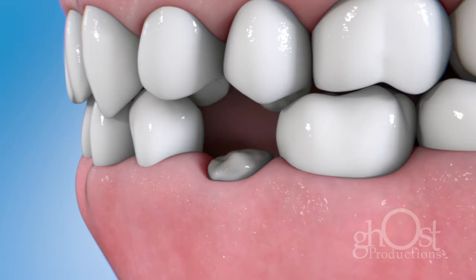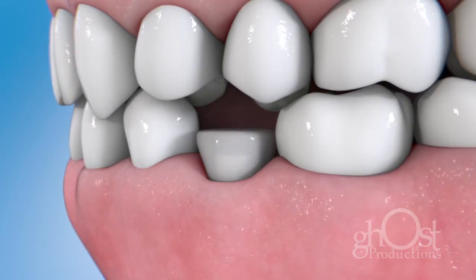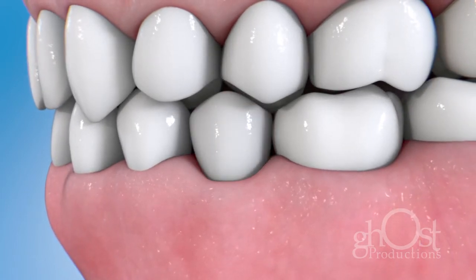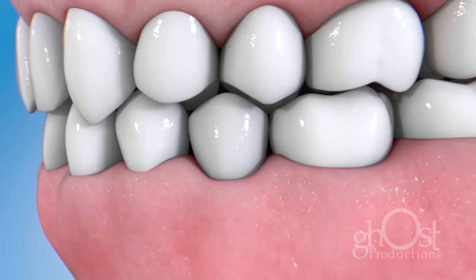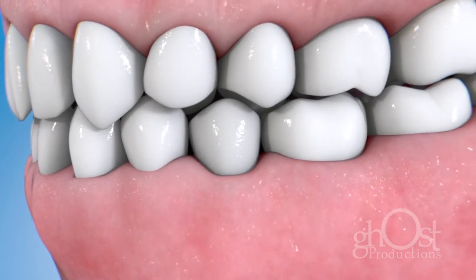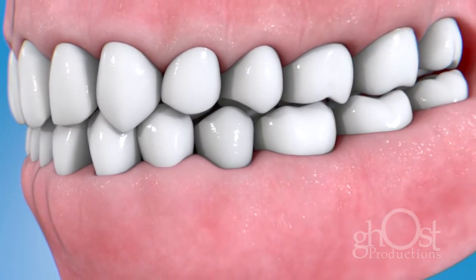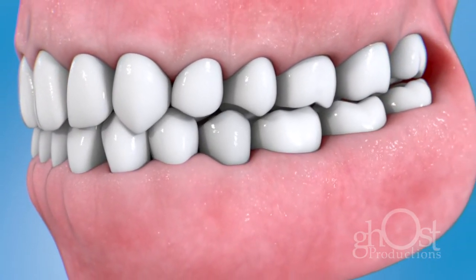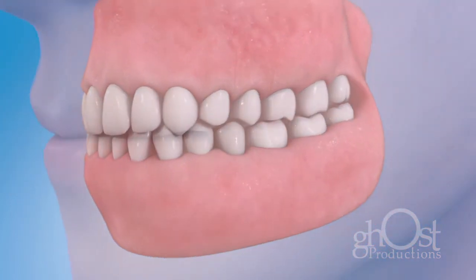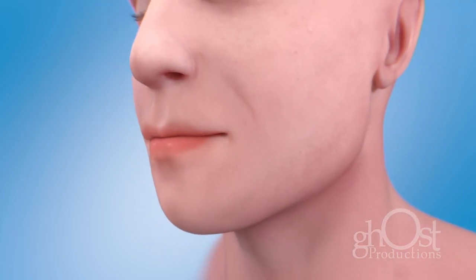It's important to follow the periodontist's instructions on postoperative healing and re-care. When the periodontist determines healing is complete, your dentist will build up the core of the tooth and prepare it for the crown. We place the crown to cover and protect the damaged tooth. This procedure saves and restores a tooth that might otherwise be lost, allows the gums to reattach properly, and makes the area where the crown meets the tooth accessible and easy to clean. Whether it's to save your tooth or give a more natural smile, crown lengthening is an important dental procedure.